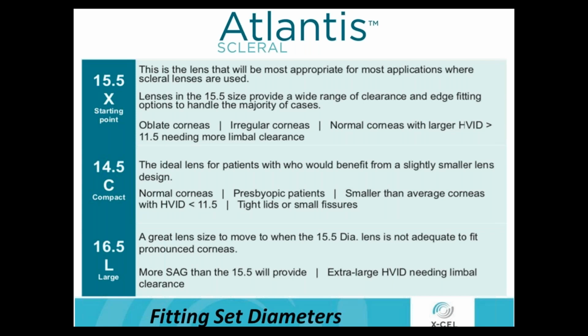So Generation 1, our philosophy was keep the lens smaller, but still vault most of the corneas. And we started out in Generation 1 with our starting point being a 15.0 diameter. And the 2 main reasons for that was we wanted to make sure that patients did not become discouraged with the application and removal process.